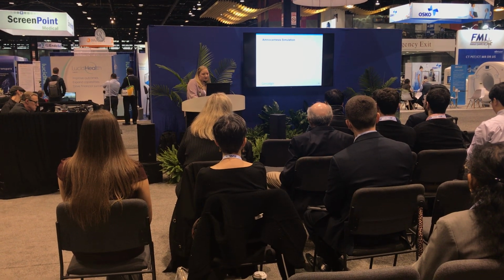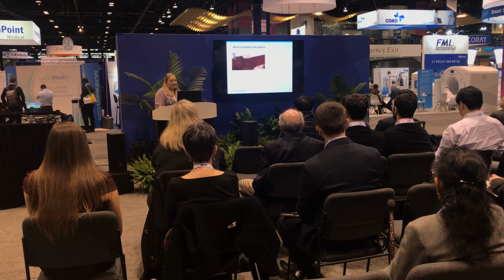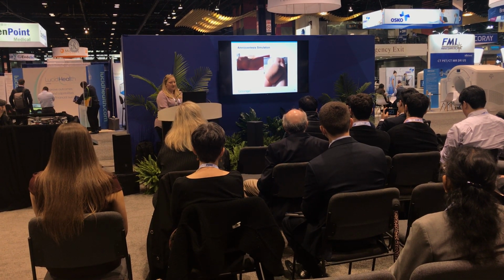And these are just some images of about where I am right now. We cut out the opening. We have the amniotic sac. There is actually a fetus in there, and we filled it with the fluid. And then I designed a baby bump that's ultrasound compatible.